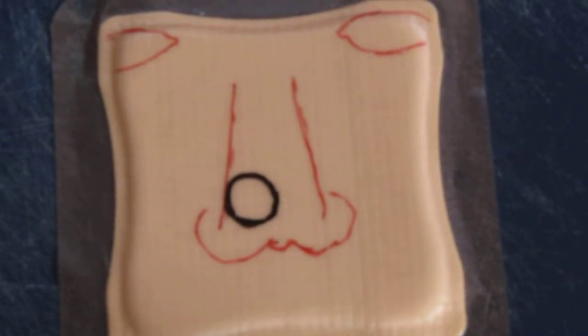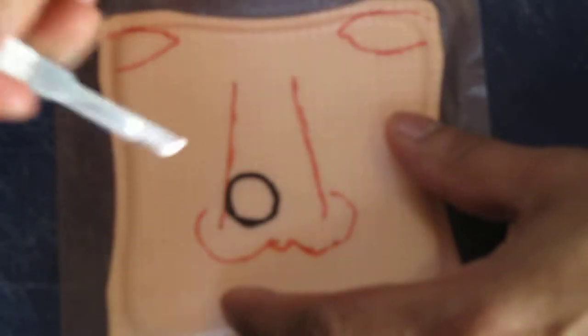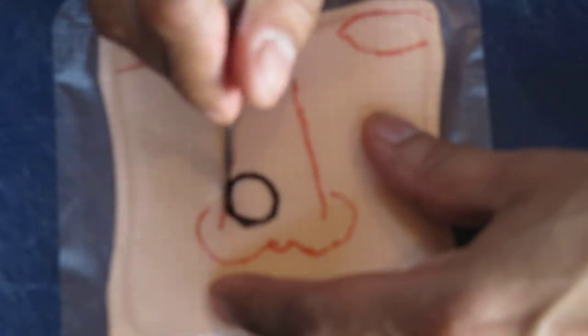Okay, so now we're going to show a bilobe flap. This is someone's nose, and these are the eyes here. It looks like he's got hypertelorism. Anyway, this is the defect, so we'll just cut around this defect and then design a bilobe flap to try and cover it.